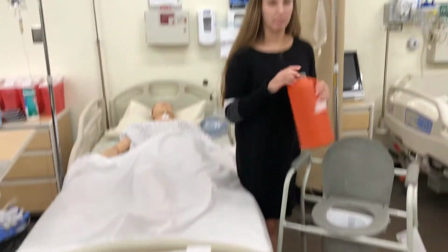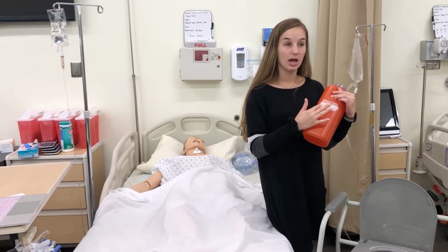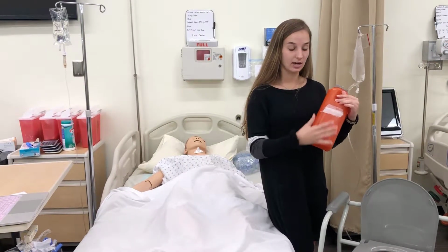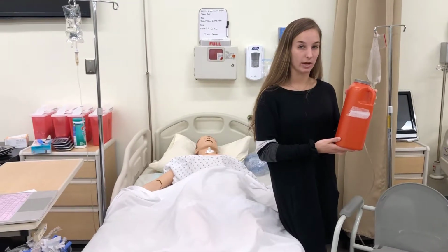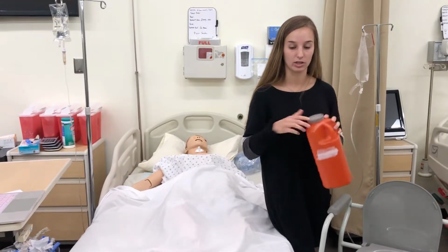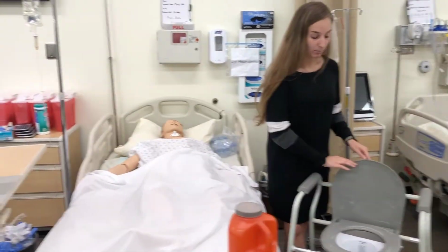Once I do have my first urine test, I would label this with the patient's name, the start date, and the time. According to hospital policy, I would either leave this in the patient's bathroom or I would refrigerate it in between each urine collection. But that would be if the patient was mobile.